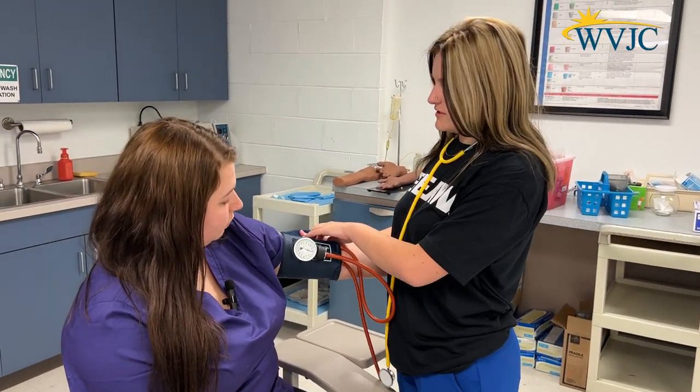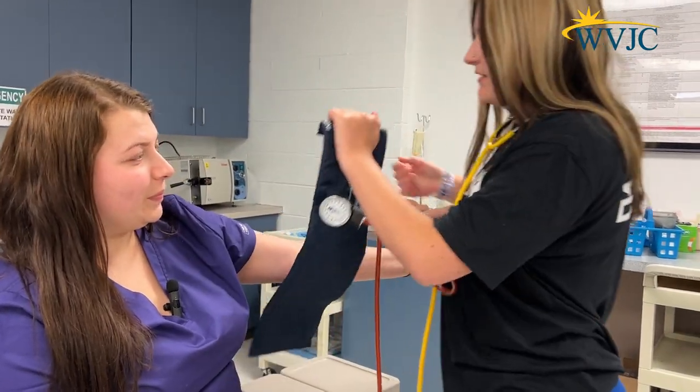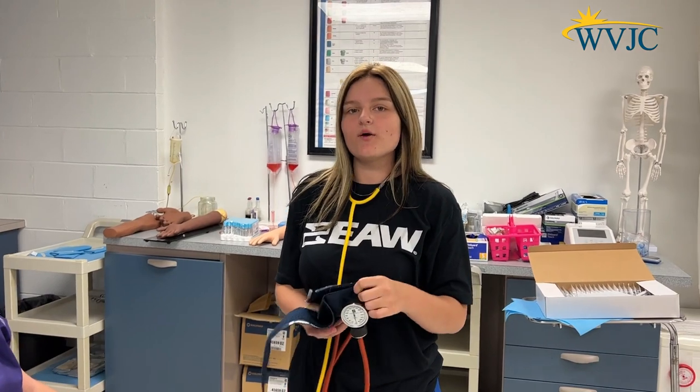So I got about 150 over 100. Her blood pressure is a little high today. The normal is 120 over 80.